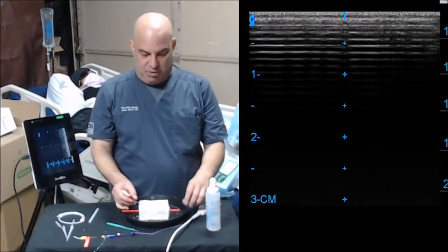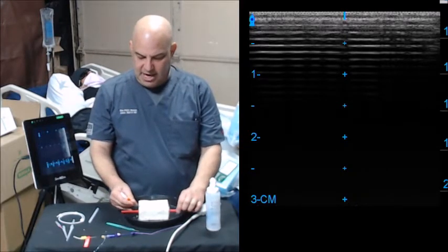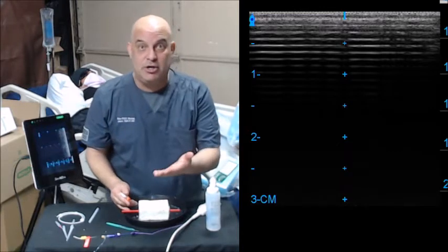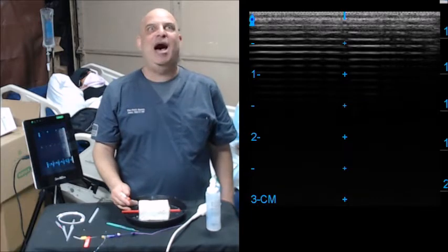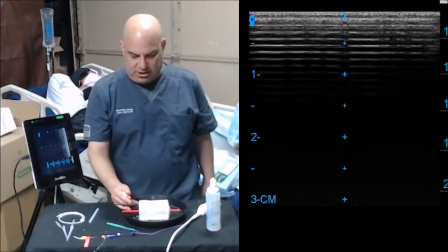If you can do this part right here, just like that, if you could do that right here, right in, you just saw me do it. Any PICC nurse company would be happy to have you, I would be happy to work alongside you.